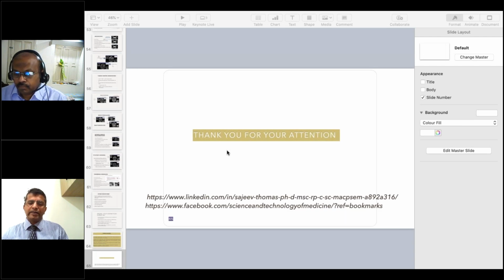There are also some phantoms we need to acquire the stereotactic accuracy of the imaging systems, especially MR, CT, and angiographic devices. There are vendors who provide such systems, but I am not mentioning the names here. Even in my experience, I have designed my own tools to perform those tasks.